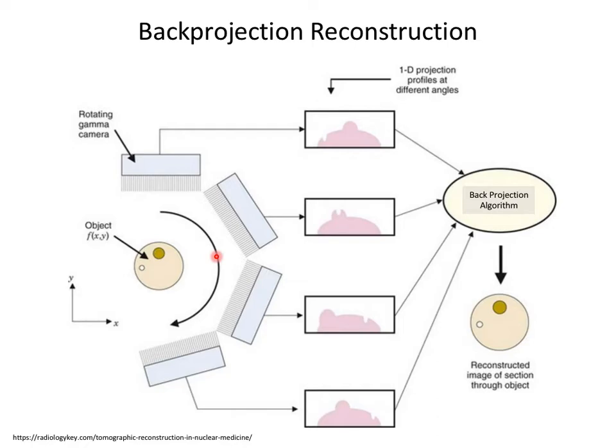Everybody get that? So I've just got a point in my scanner, and I want to make a picture of where that point is. How many projections do I need? I need 2. Say this was a tiny dot. From this projection, I know it's somewhere on this line. From a 90-degree projection, I would know it's somewhere on that line. And if it's a tiny little dot source, then I know basically where it is. But I have to know ahead of time it's a dot.